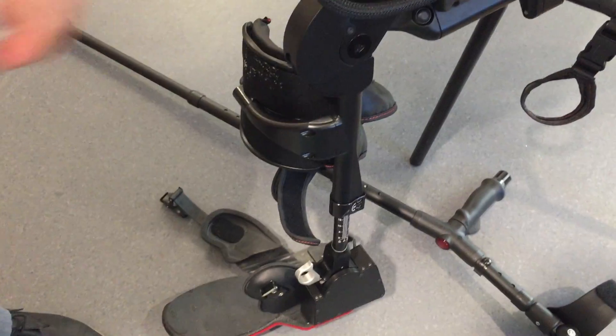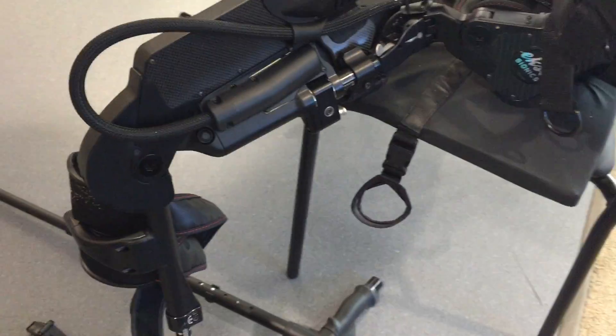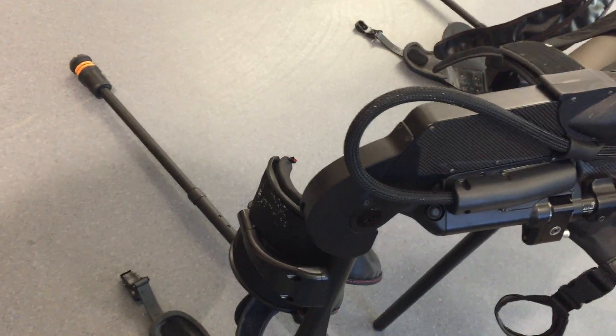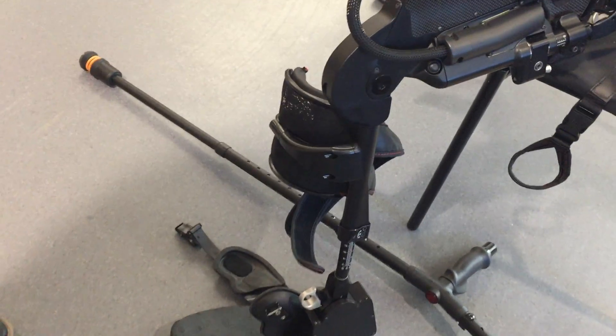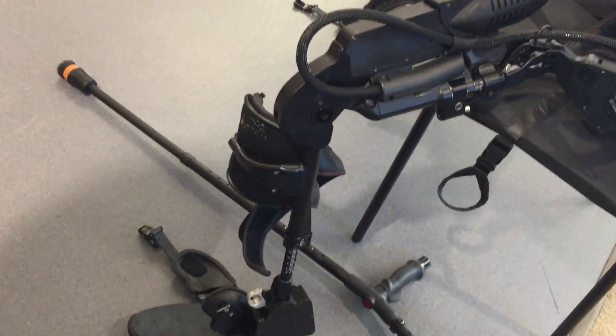There are assistive motors at the knees and at the hips to help with that. There are also foot sensors that provide real-time feedback thousands of times per second on how much assistance is actually being provided to the patient.